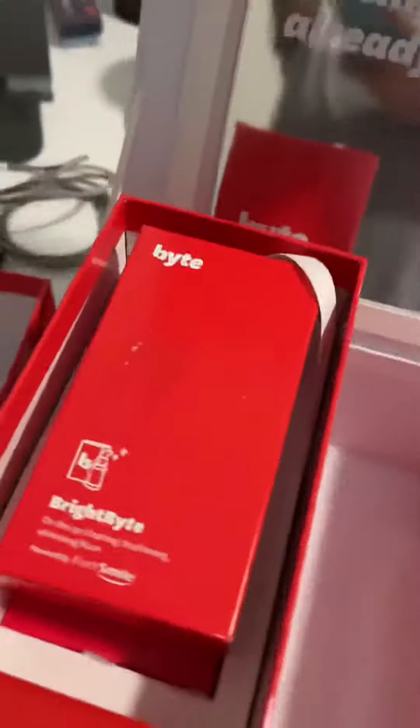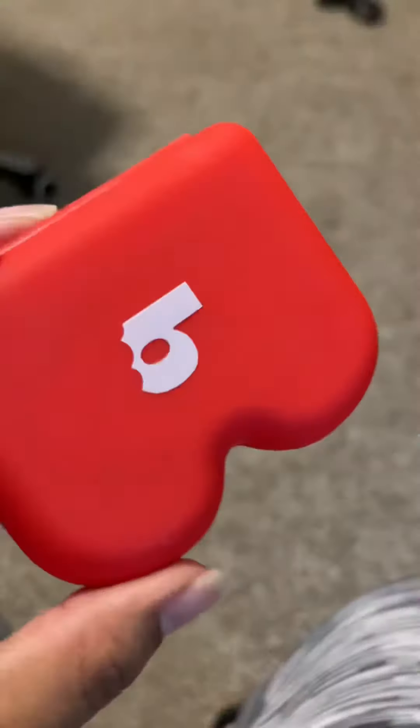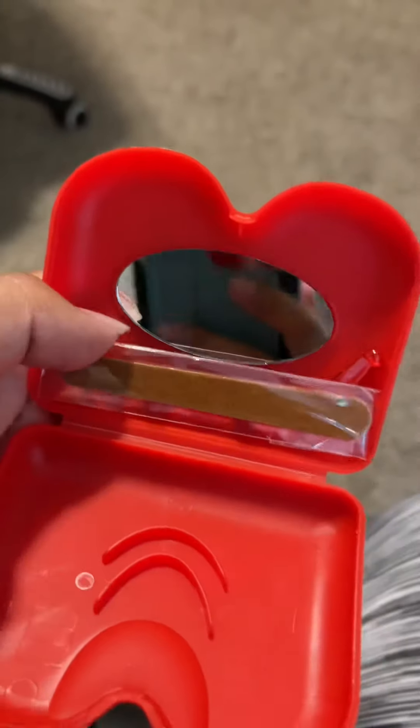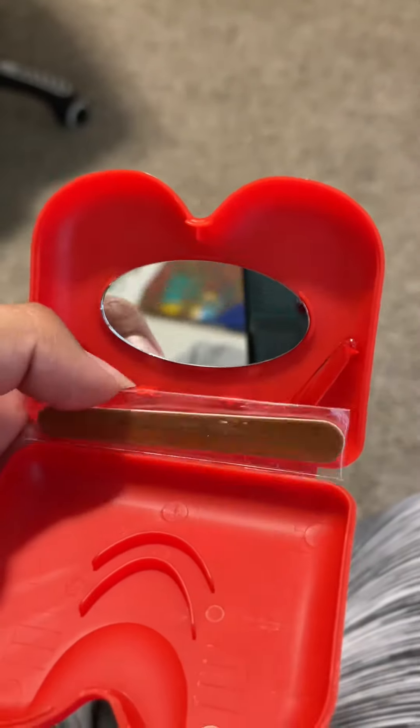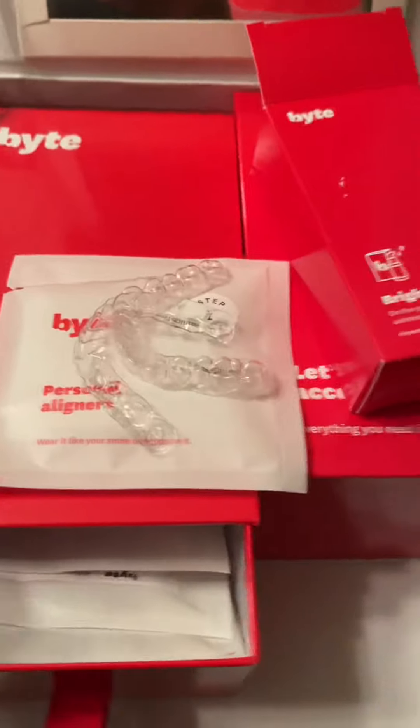Some of these only have one. I got a little retainer case — kind of cute. Look at this little tab. This is my HyperBite. You get this little case, you open it and it has a little mirror, which is cute. They also give you a little file in case the aligners are irritating you, and then your extractor tool.